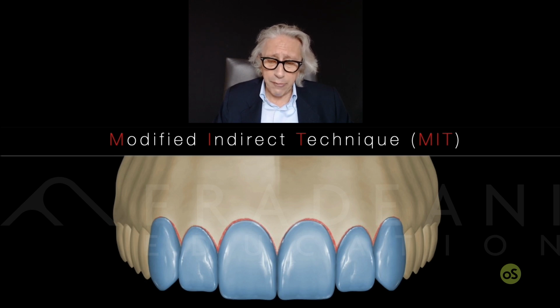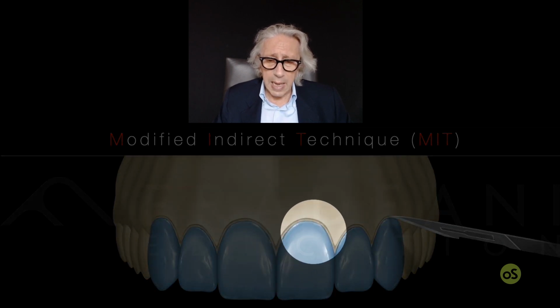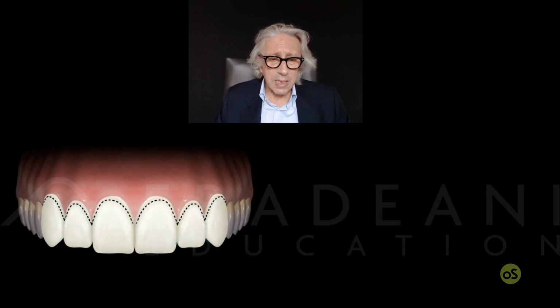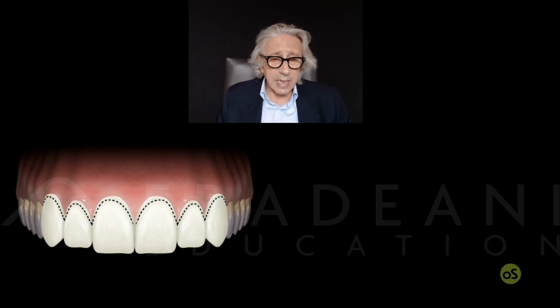But that allows you to have a perfect insertion of your restoration, of your shell, inside the abutment, perfectly fitting, because it doesn't create any friction on the cervical area. It will be free to move because the margins are longer, as I said, and automatically larger. So more or less what happens is like that. We will have your margin inside the shell, because you will not have friction in any place. We will not have a problem inserting it, maybe inclined to one side.